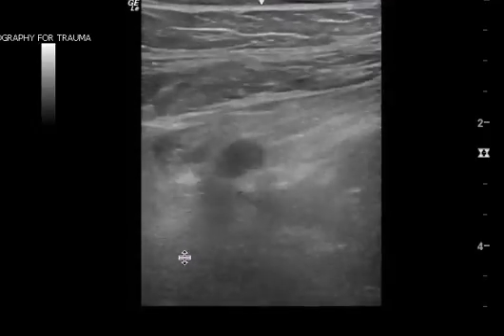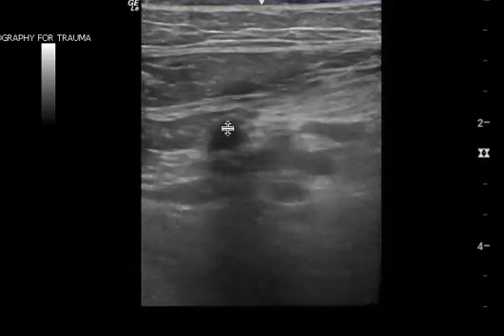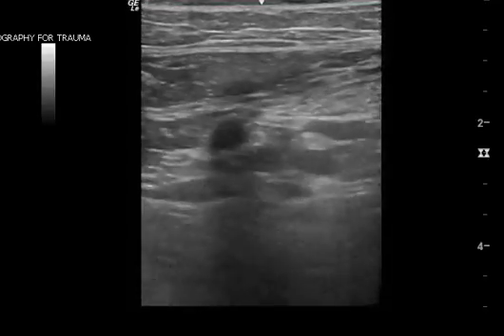It's really important that you get the Mickey Mouse view in the very beginning, which is where you have the common femoral vein as the main vein, the artery as one ear, and the saphenous as the other ear. I hope this helps — let me know if you have any questions.